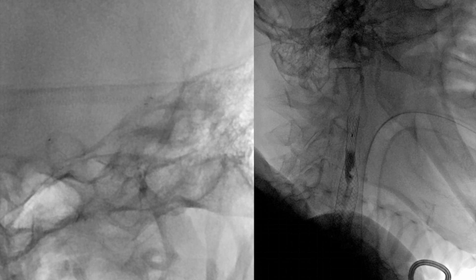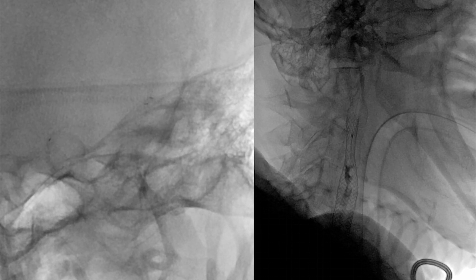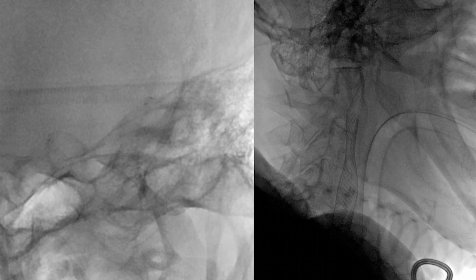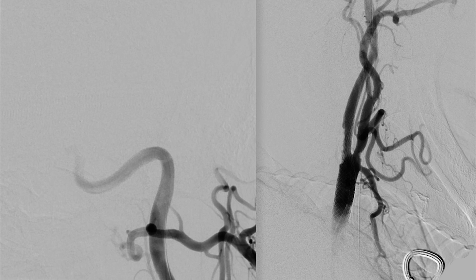This cervical part takes about five minutes. After that, we perform a control angiogram to assess the intracranial situation. As you can see here, the stent retriever is still in the position where we initially implanted it, and we have already treated the cervical stenosis.